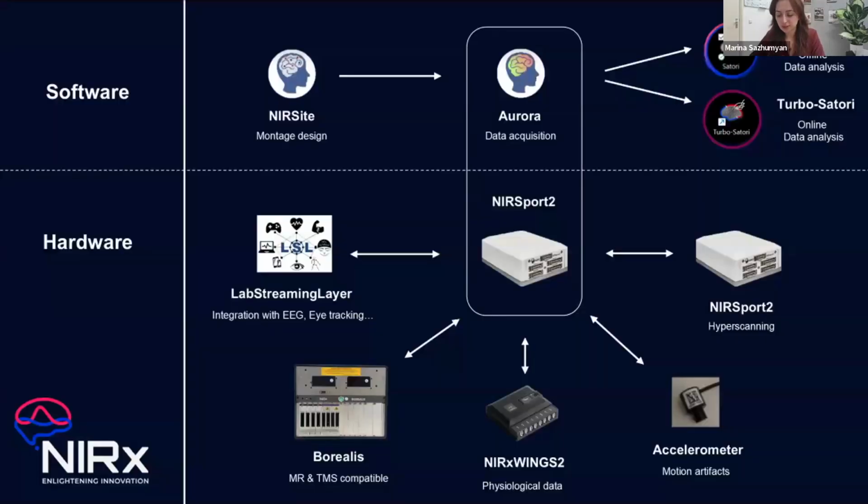Wow, thank you very much for the very kind introduction, and thanks everyone for joining our webinar. This is again a refresher training of the Aurora data acquisition software. And before we dive into the existing and the new features in Aurora, I would just like to take a step back and look into the bigger picture of where this software belongs. So Aurora is the data acquisition software, which is part of the NIRScout platform, or the NIRScout ecosystem, as we like to call it.